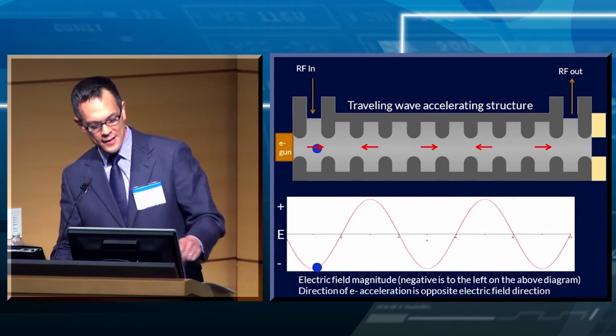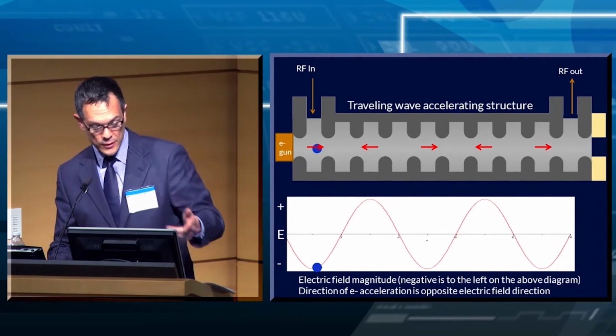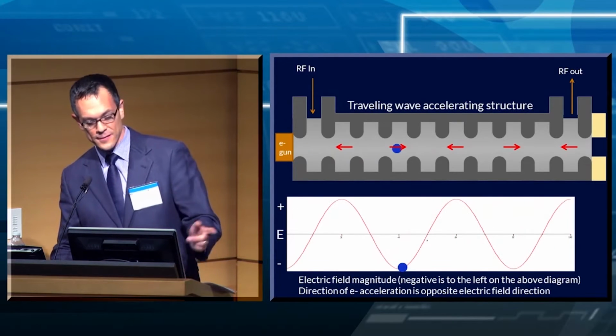So to back it up, whenever, in this cavity, the electric field's negative, so it accelerates the electrons, and then at the same time they get to the next cavity, it's still negative, so it just surfs along.